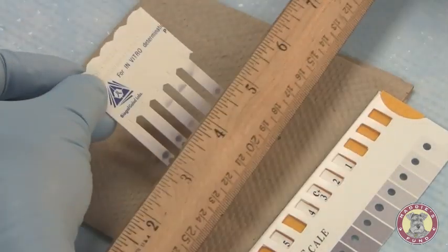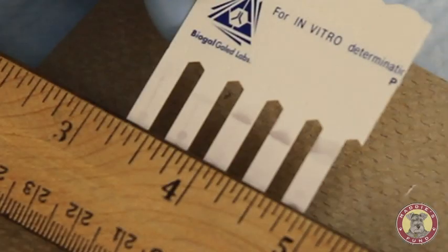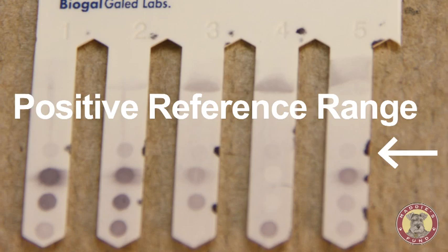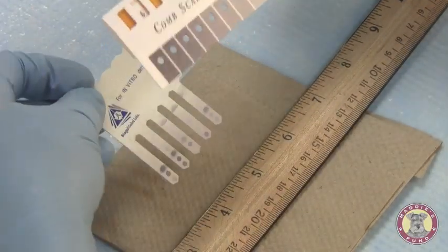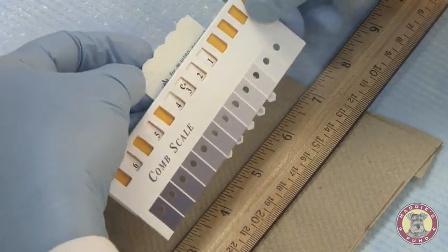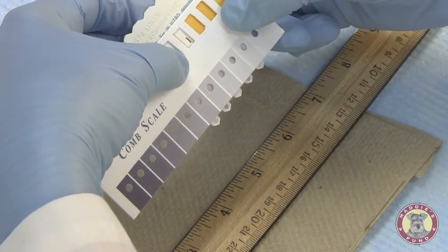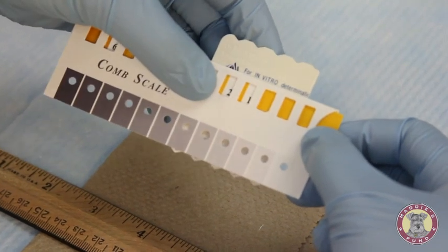Using a straight edge, I'll look at the first row of dots — that is our control slot. This is the positive reference range. These should all be a similar color. Using the comb scale provided in the kit, I will try and match this positive reference to the color provided.